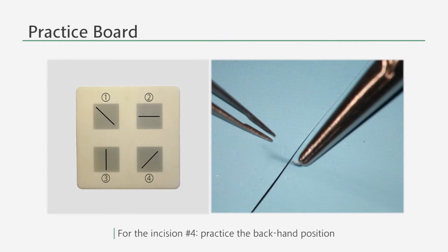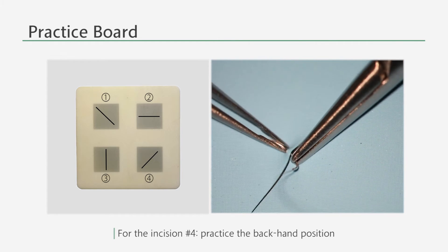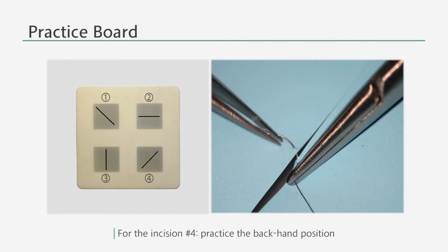For example, for incision number four, you can practice in a backhand position.